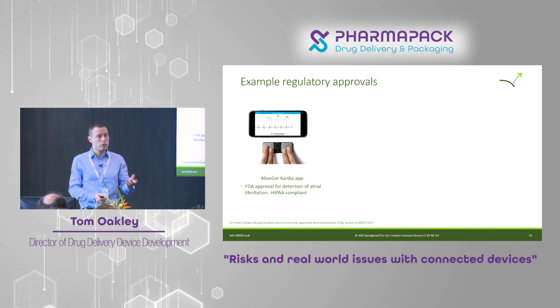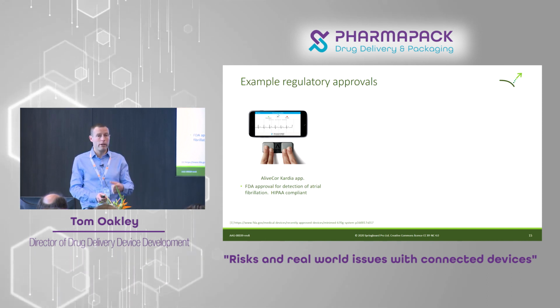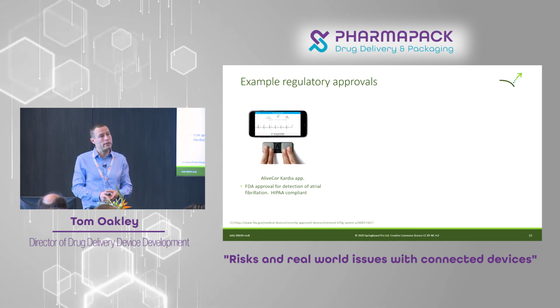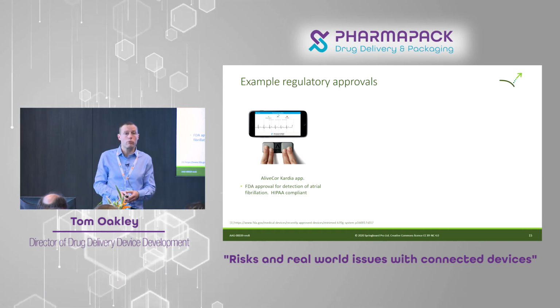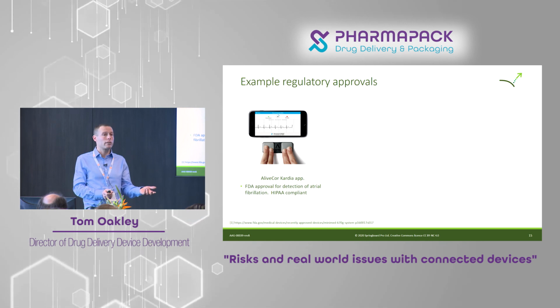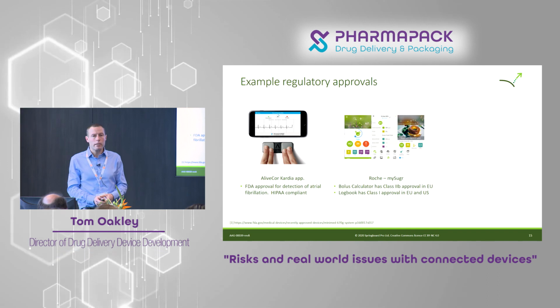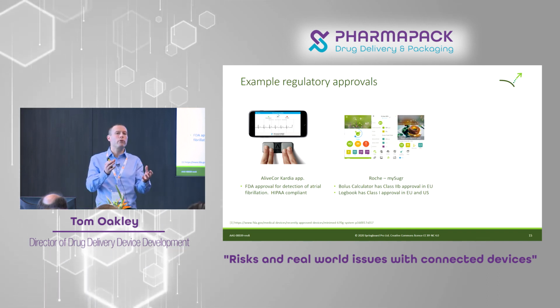If you get a chance to talk to people from AliveCor, they're very good at explaining how they did it, and they're very open with explaining sort of what worked and what didn't work for them and how they did that path. I can put you in touch with them if you're interested. So that was a real groundbreaker. It's the first time the FDA said, okay, you don't have control over iOS, but we will approve this as a medical device.